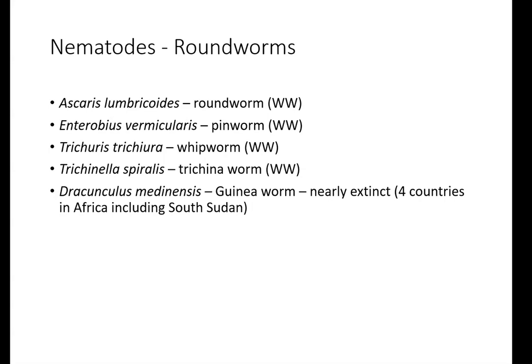So you have to understand that when we're talking about parasitology, primarily we're talking about looking at ova and parasites. But we can find them anywhere. We can find them in urines. We can find them when they're doing GI scopes, upper or lower, and they collect tissues and stuff, you might find them in there as well. Okay. So when we're looking at blood smears, you might find malaria, right? So malaria, again, it's a parasite. So you have to keep an open mind when you're looking around on those slides.